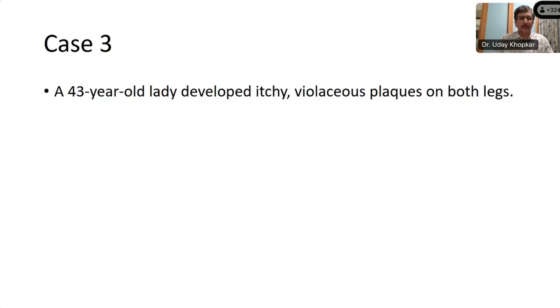And the 3 stages: acute, characterized by vesicles or edema, and edema in the dermis as well as in the epidermis with spongiosis, and subacute with a combination of hyperplasia of the epidermis and this spongiosis, as well as a bit of parakeratosis and a scale crust, and chronic, which already Dr. Rajlakshmi has shown as lichen simplex chronicus, which is the end stage for most of the eczemas. Thank you.